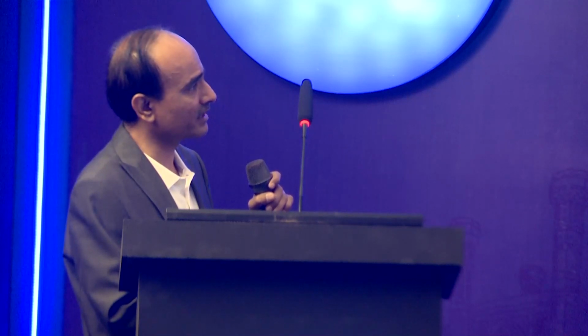So at this point, we had 2 or 3 options for the balloon. The best is to remove this out. The second, the other acceptable option, is we place another stent and deploy it, crush it around the left main and bury it. The third option is we get it down into the tip of the LAD if we are not able to do anything else. But the best thing was to remove this.